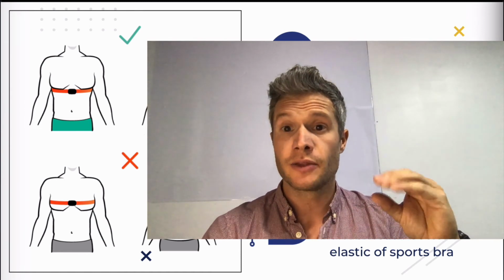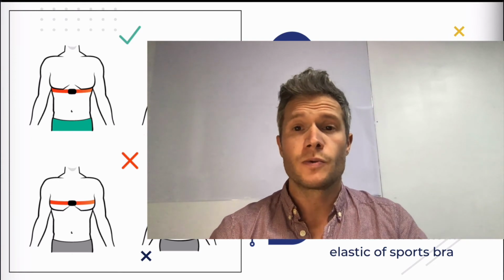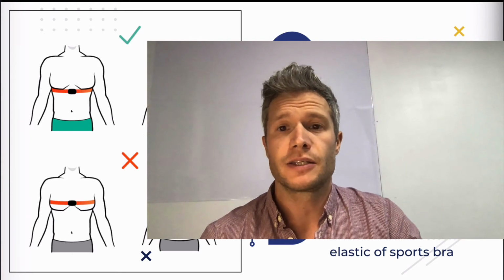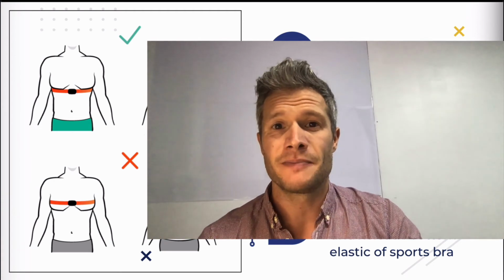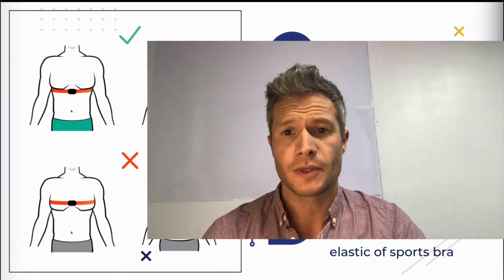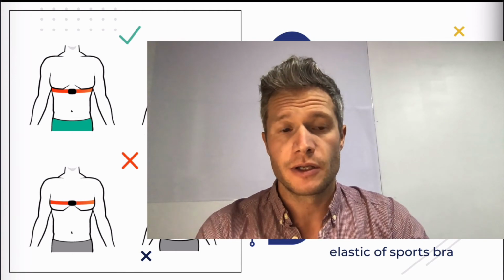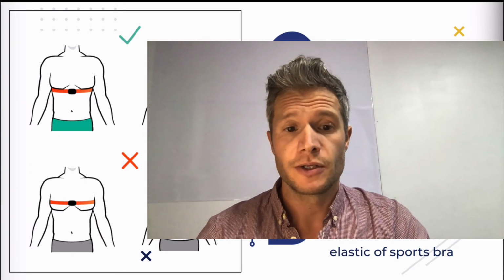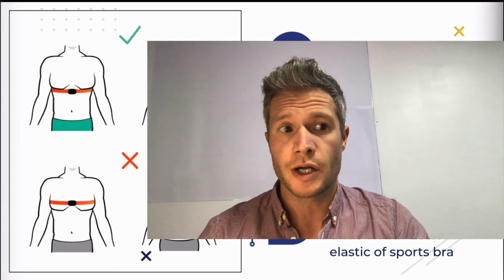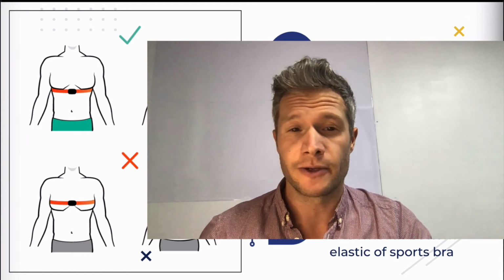The way it tracks is that color change. So you are getting an indirect measure of your heart rate. Compared to the biometric heart rate strap, which is a direct measure, it leads to a greater capacity for error, so it's less accurate.